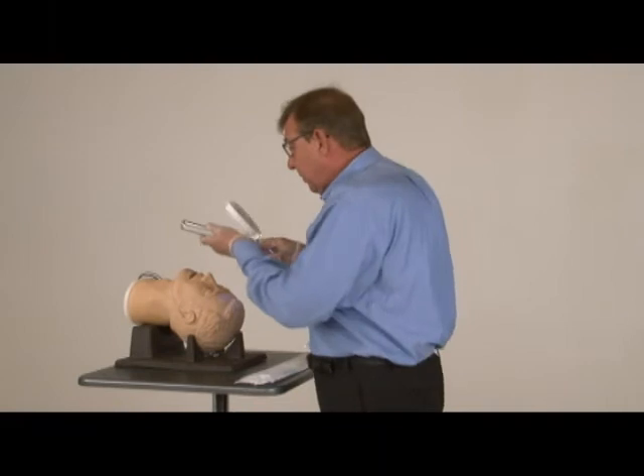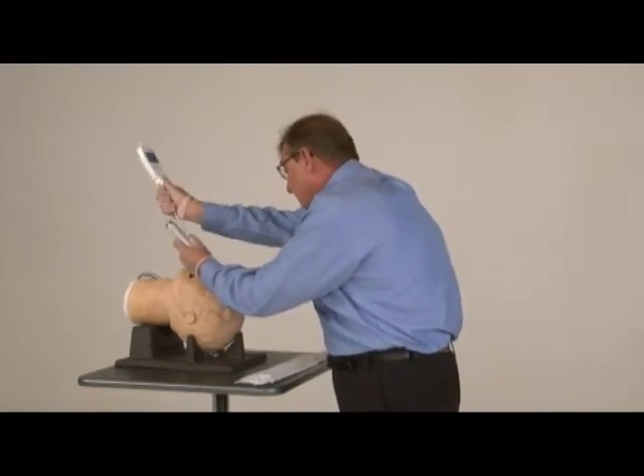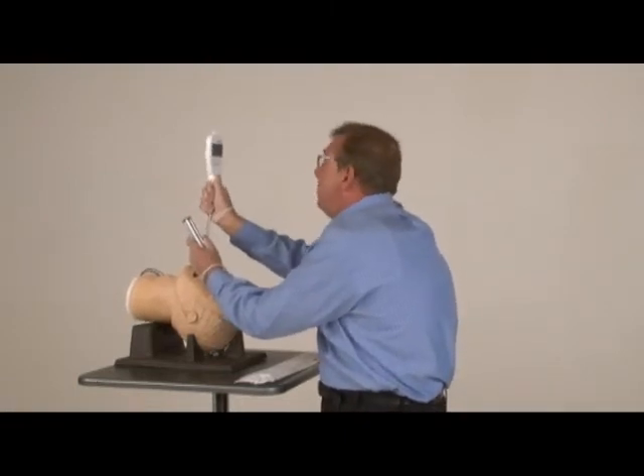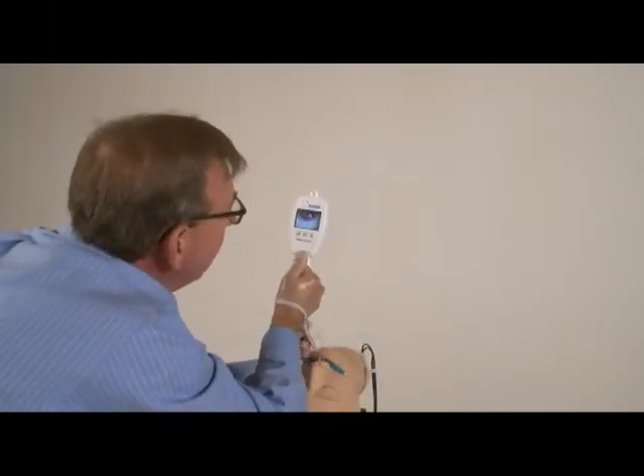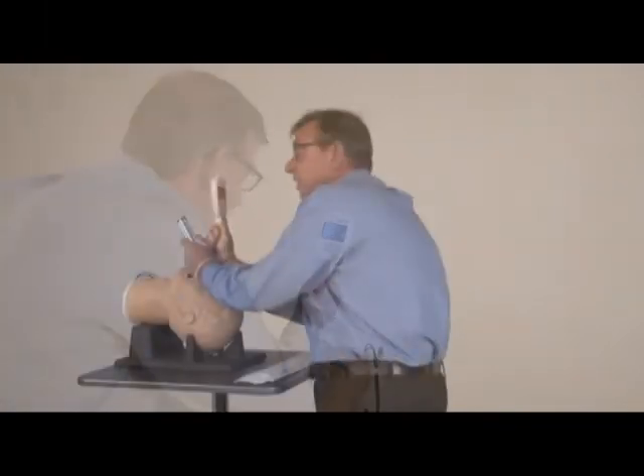I'll demonstrate. We insert the laryngoscope, then follow with the tube and stylet. Get a good view on the screen of our cords and just slide it right through. If you need to, you push forward on the screen so that you're able to maintain a direct line-of-sight view.